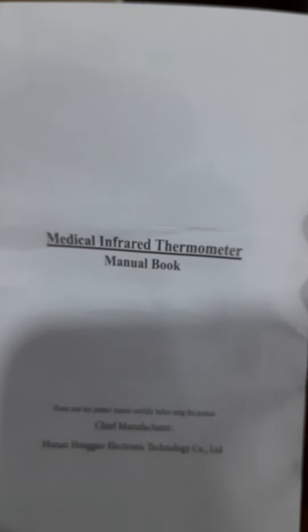I will add the extra items. I will add the manual. Inside we have the thermometer — a Medical Infrared Thermometer.